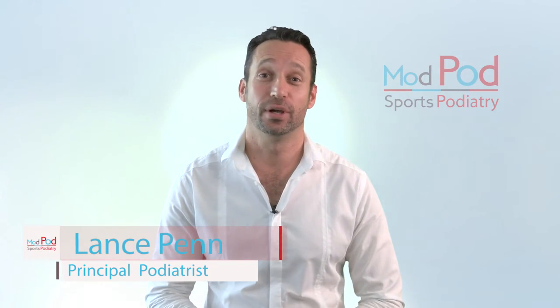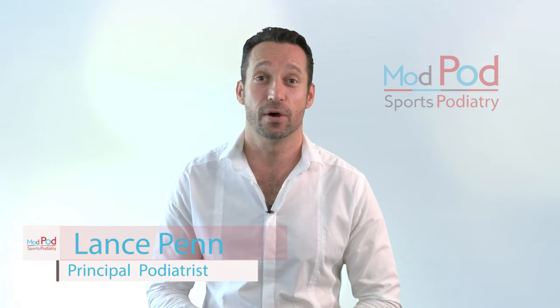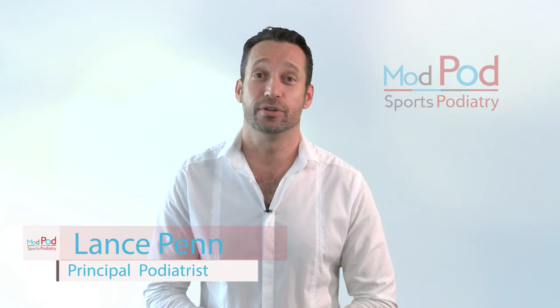For those ladies who are pregnant, unfortunately, we are not allowed to use the cold laser on you, and not because it's not safe, it's just that during the trials and research on the product, they are unable to test it on pregnant women. You would hate to have any adverse effects, so unfortunately we cannot use it. Some of our ladies do check with their specialists, and on occasion we do get the go-ahead to use it. It is safe, it just cannot be tested and proven.